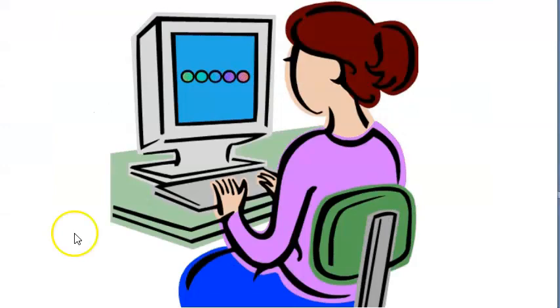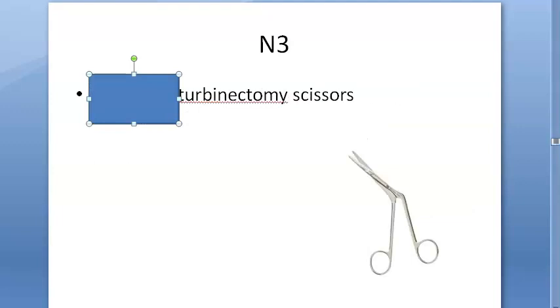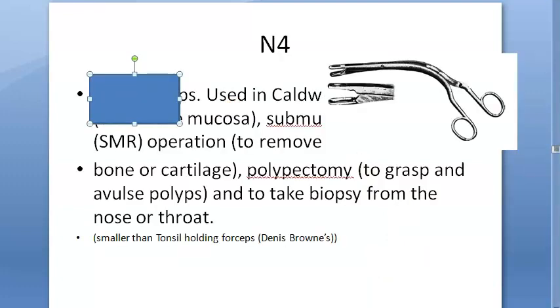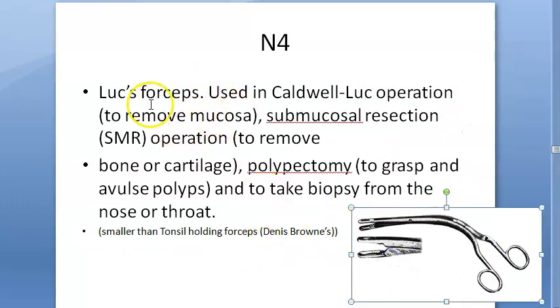Now let's see if you can identify the instruments. This one is double-sided — it is an elevator. Which elevator? It's the Freer double-end elevator. This next one is scissors — turbinectomy scissors, which is Heyman's. Next, this one you hold — it's not to be confused with the tonsil holding forceps. This is Luc's forceps, going inside the nose, used for the Caldwell-Luc operation.